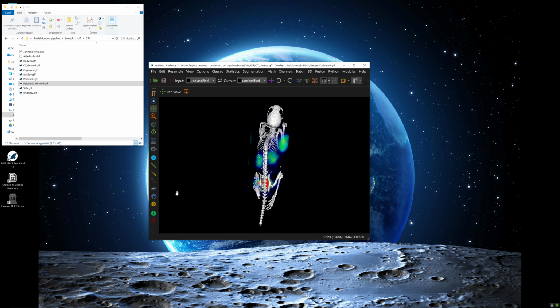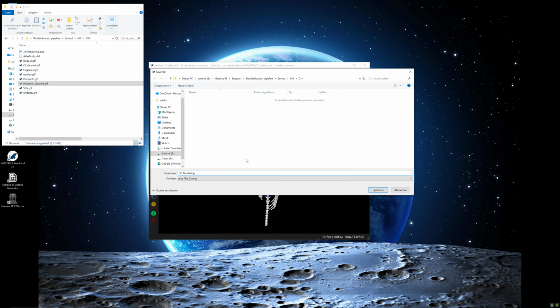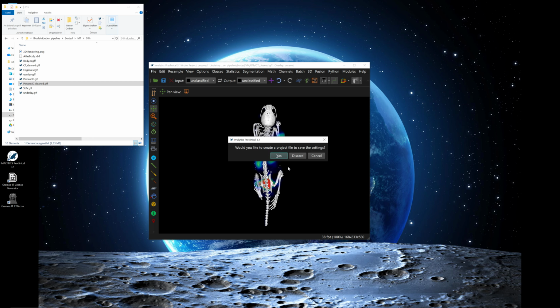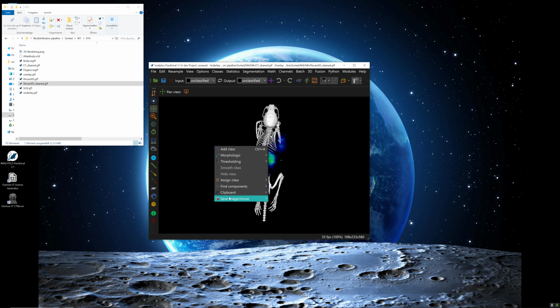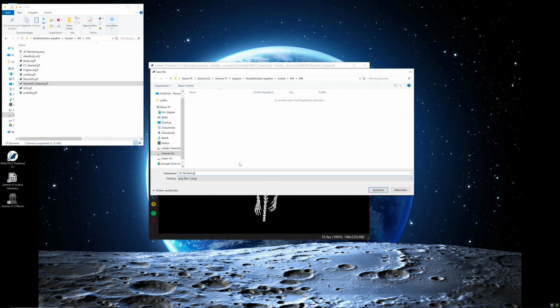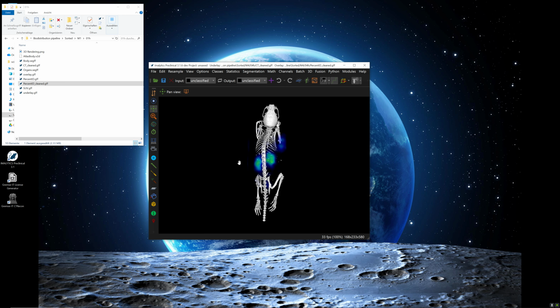If you have something like here, you could also remove that. So save. Next one. Okay. And the last one.